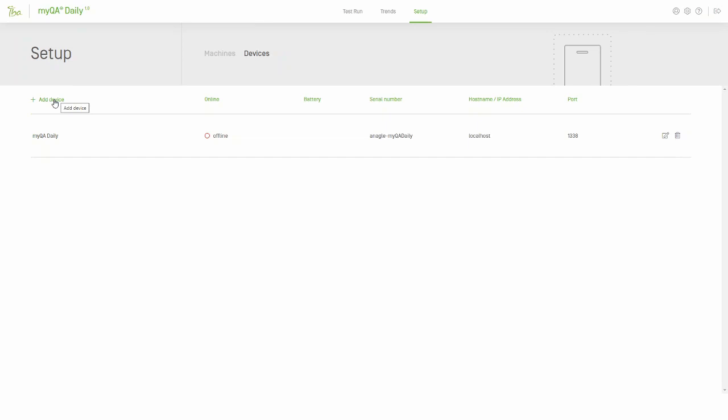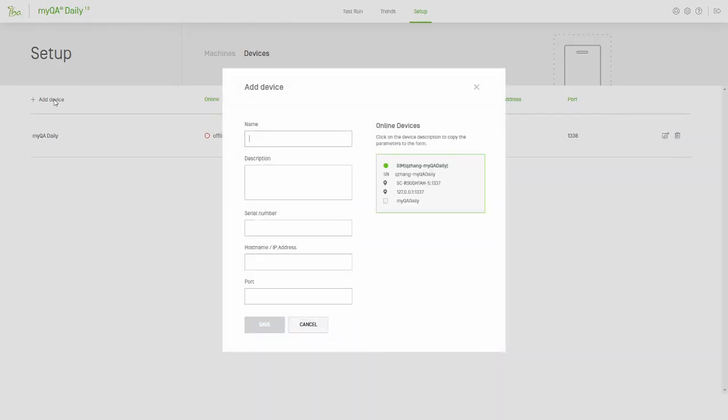Step 1. Go to the setup page and select Devices. Then click Add Device.